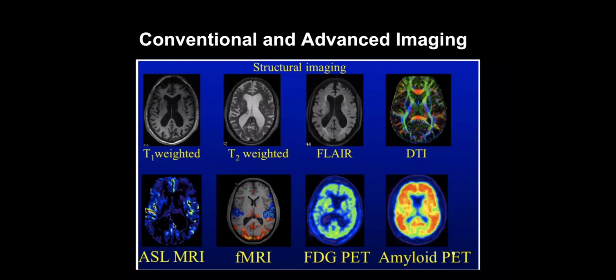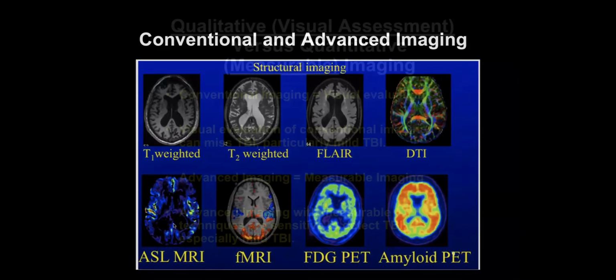However, we don't use PET to assess traumatic brain injury because there's limited access for PET scans in the United States. There are only about 2 million PET scans done per year. Most of those are done for oncologic assessments. And then, of course, you compare that to MRI, where we can do upwards of 40 million scans in the United States without radiation. And of course, as I'm going to be talking about traumatic brain injury, none of these assessments require the use of any sort of contrast agents whatsoever. And so it is truly the most minimally invasive, high-resolution imaging test we can get for a patient that's also widely available to patients at the same time. And so hopefully that provides some important context.